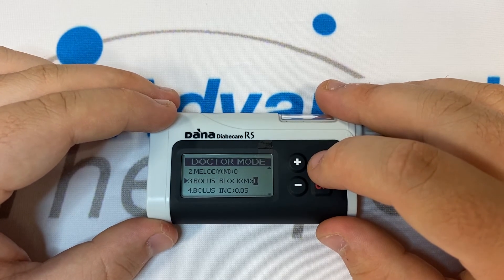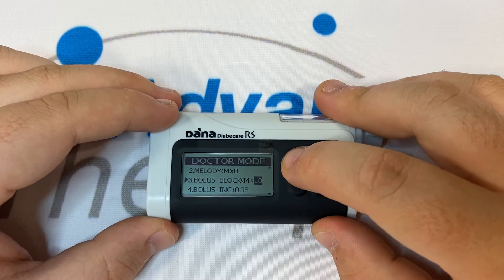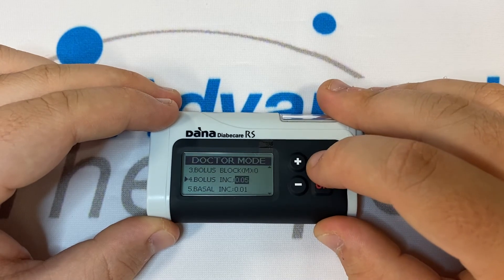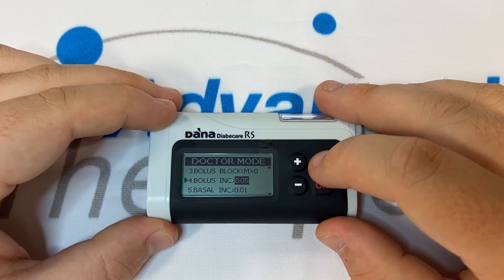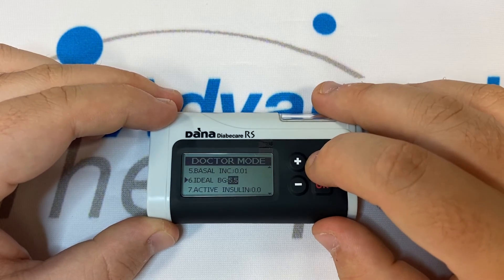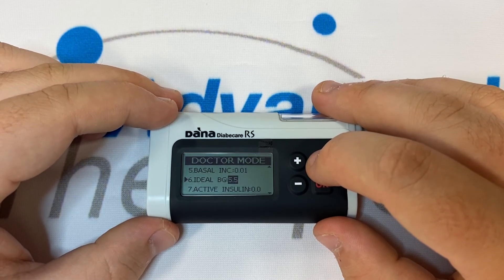Bolus Block is set in 10-minute increments. Number four is Bolus Ink — these are the increments we can move in when setting a bolus. For the most part, we set this to the minimum, 0.05. Number five is Basal Ink, and for the same reasons as Bolus Ink, we set this to the minimum, 0.01. Number six is Ideal BG — your target blood glucose — which defaults to 5.5.